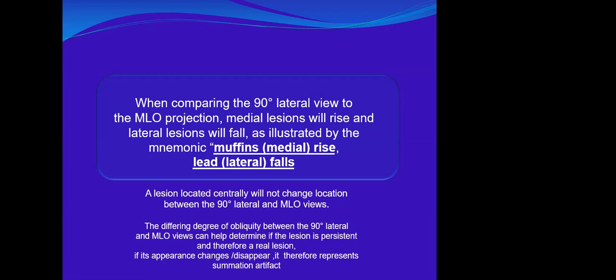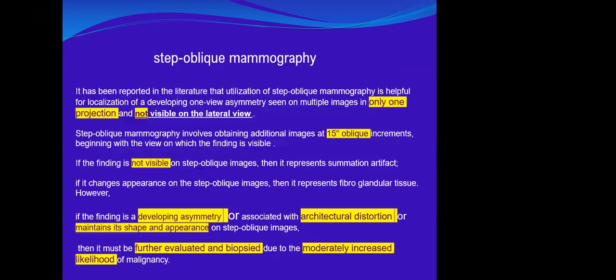Tomosynthesis? Yes, we are doing tomosynthesis. But before tomosynthesis, we have what we call step oblique mammography. In the previous, from the oblique view, we shifted to 90 degrees.